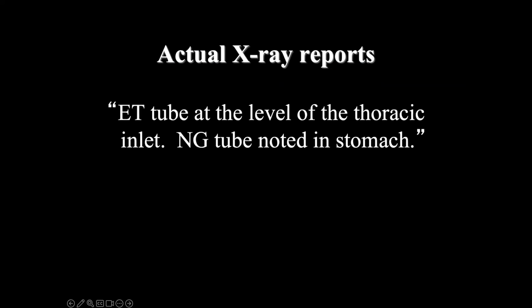Okay, well, we've all been here, right? We go to the x-ray report and there's nothing there, but I want to show you, these are just a few of the more generic blurbs that I've seen over the years on more than one occasion that really doesn't add too much to the overall interpretation of the image.